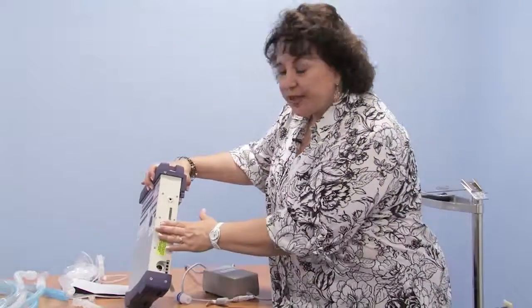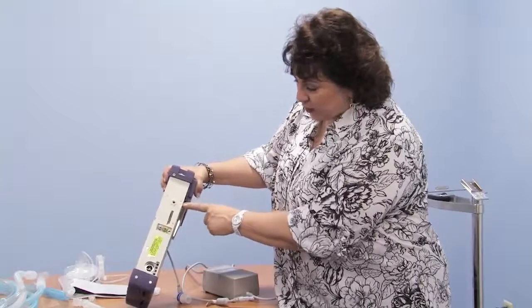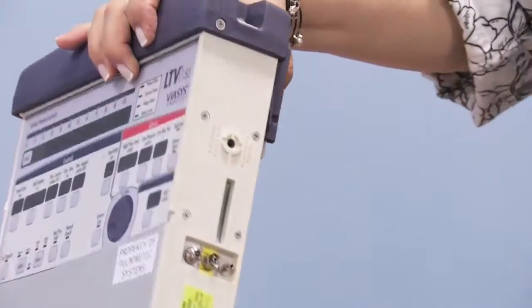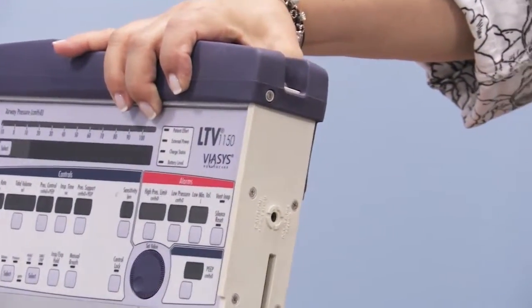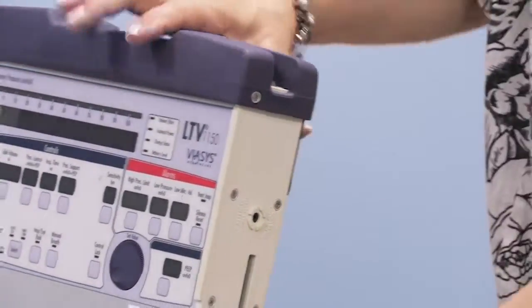So these are important connections to make. Above here you see a little round circle and it says, do not block opening, caution audible alarm. So that is where the sound comes out for you to hear an alarm from the ventilator. Obvious reasons you don't want to cover that.